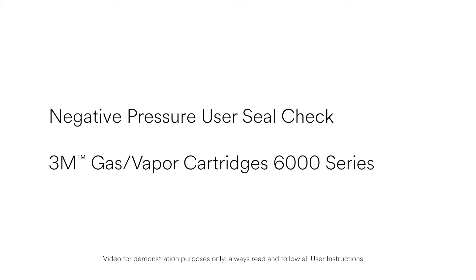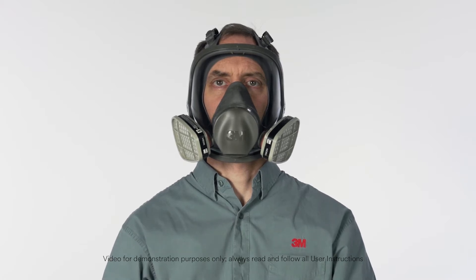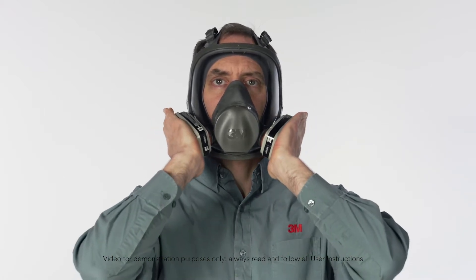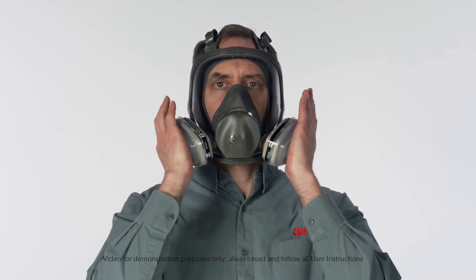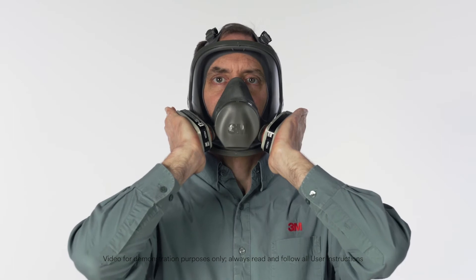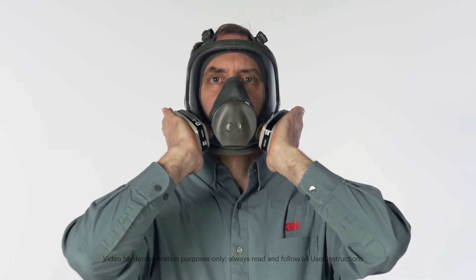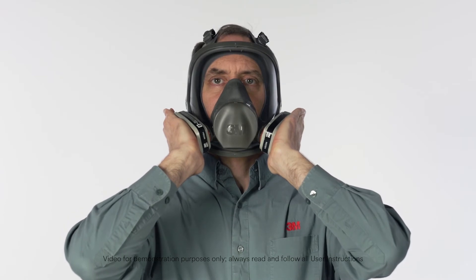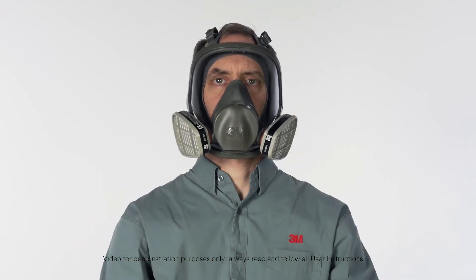To perform a negative pressure user seal check with 3M Gas Vapor Cartridges 6000 Series, cover the open area of the cartridge with the palms of your hands. Filter retainers may aid in conducting a negative pressure user seal check. After you've sealed the cartridge inlet, inhale gently. If the facepiece collapses slightly and you feel no air leaking between your face and the face seal, your respirator has sealed properly to your face.